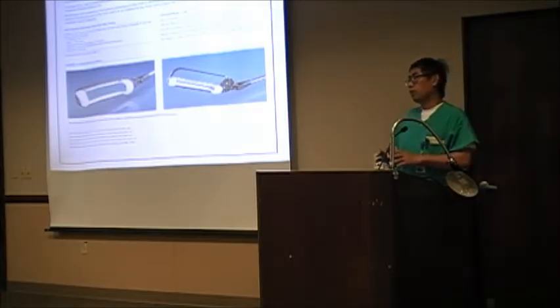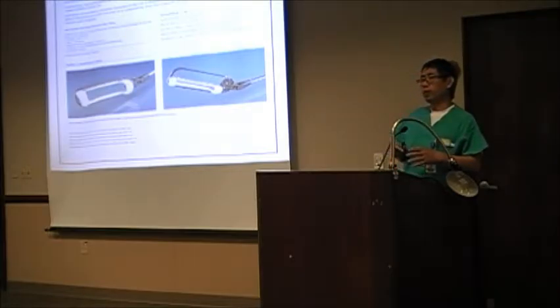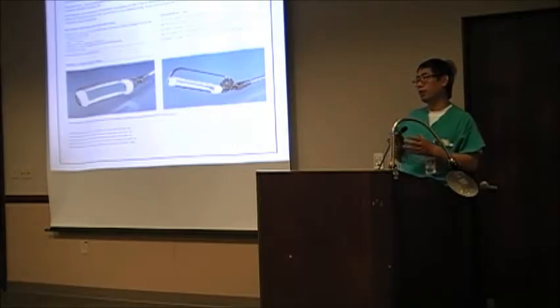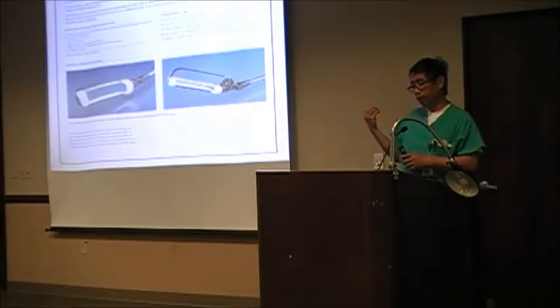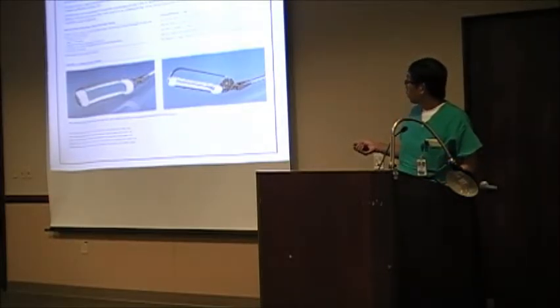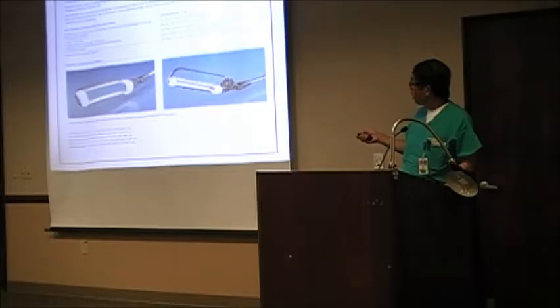Now we talk about the surgical approach. No surgical device is approved by the FDA for appendage closure only, for atrial fibrillation. But when people do surgery, for example valve replacement, and the patient has a history of atrial fibrillation, some doctors take the appendage out, staple it, and take the tissue out. Some doctors use a closure device called AtriClip to close the ostium of the appendage. The material is titanium inside and fabric outside, and when they close it tightly and deploy it, the tissue sits in this area.